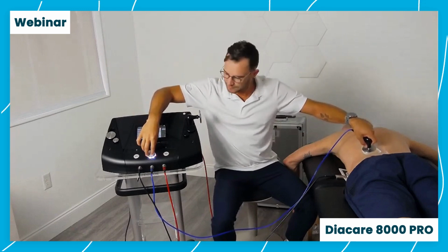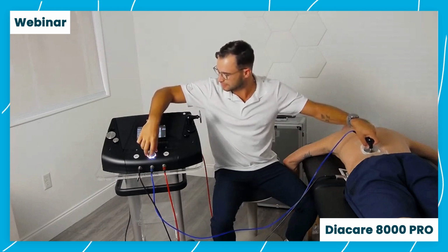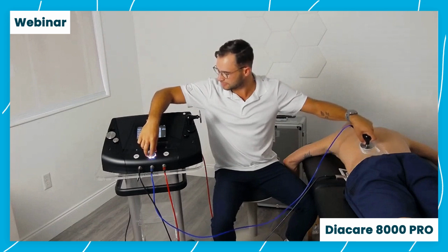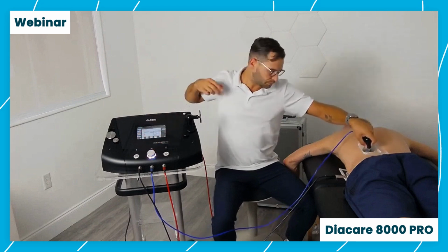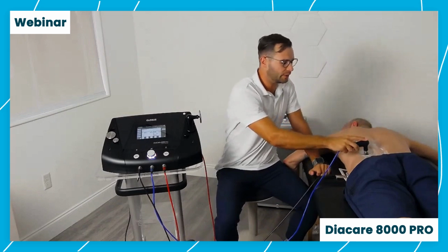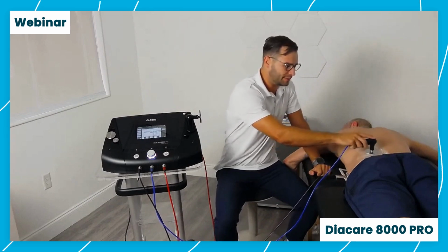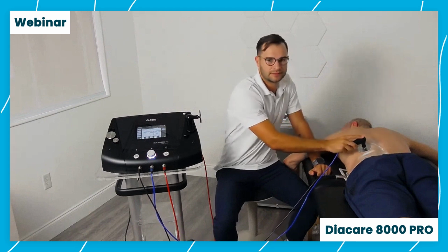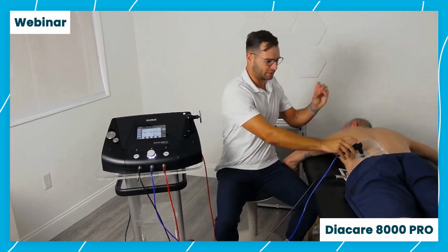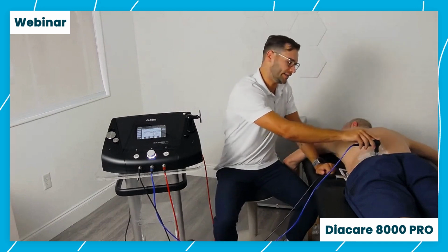So once again, same similar situation. We're going to start by turning up the intensity, moving the head of the electrode around. And this time, as we were saying before, we're going to be going after those deeper structures. We're going to be targeting the areas with the most impedance. So wherever the most impedance is, that energy is going to get bound up, and it's going to create more heat in that area.